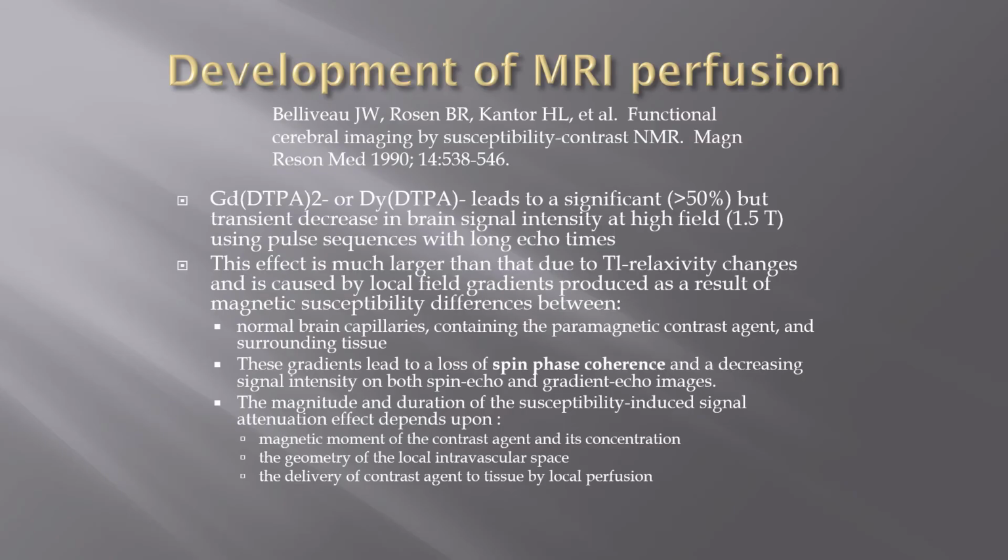All right, we're done with the diffusion, and now we'll talk about MRI perfusion. First published on this in 1990, so it's been around for a while. It wasn't applied clinically at that time. It wasn't readily available. The EPI gradients that were needed were rather expensive and probably not clinically available even. So this was on a research scanner.